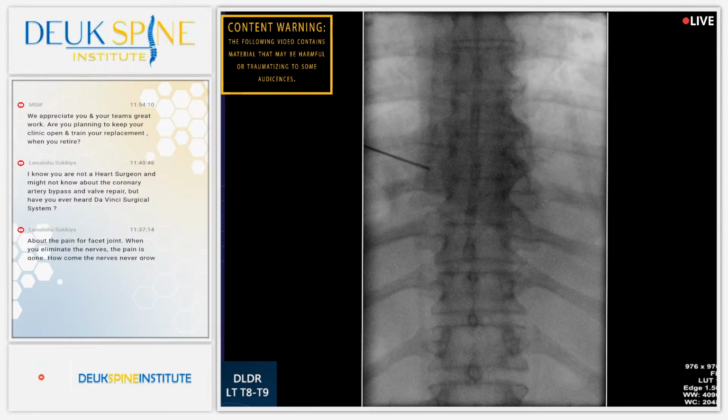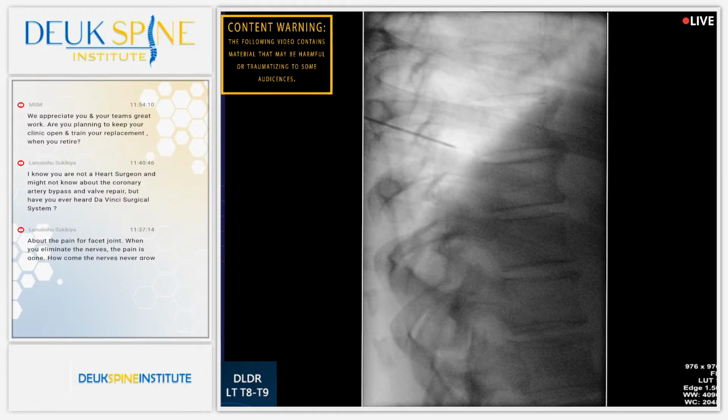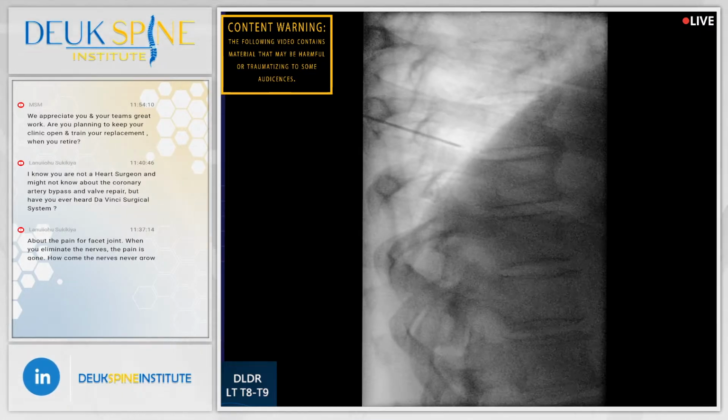How is he doing? That's fine, but he's breathing good, ventilation good, oxygenation good, vitals are good. All right. I appreciate that. That's helped. Not having a moving target's always better. But there's just all this arthritis here.